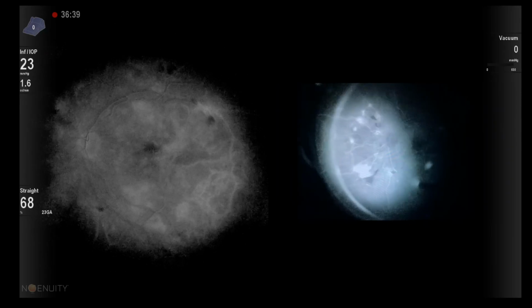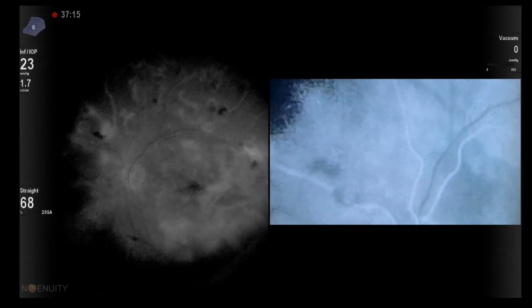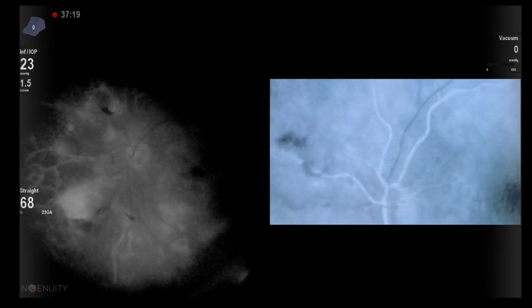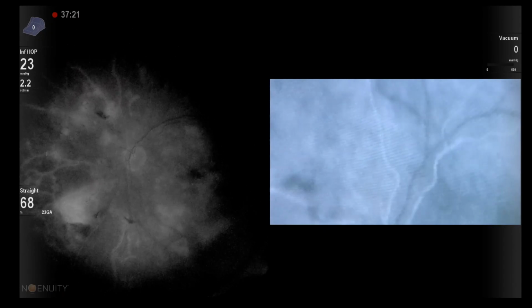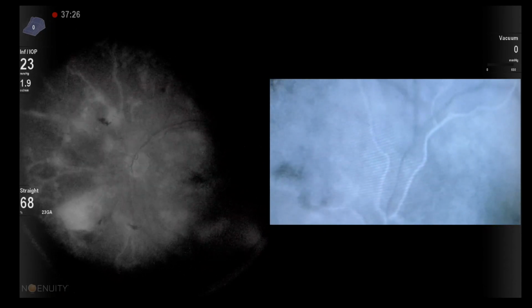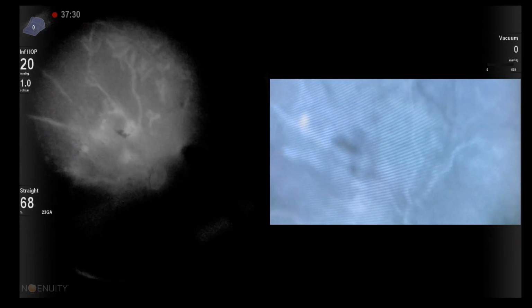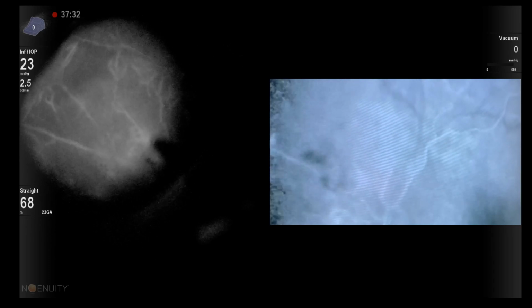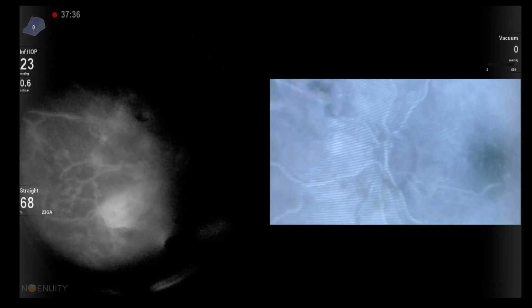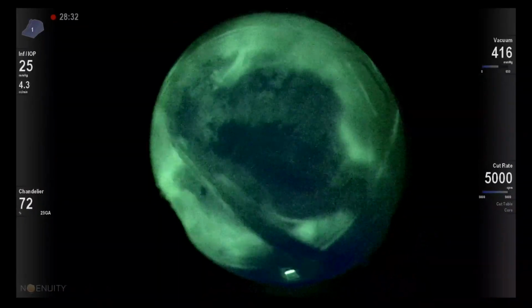Also, if we have a video shot on the fluorescein angiography, we might overlay it with the late images and see the structure and the function of all the vessels of this particular fundus. So I think it's important to have it during intraoperative maneuvers.